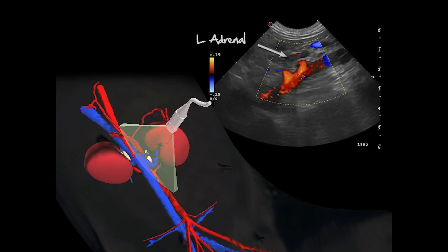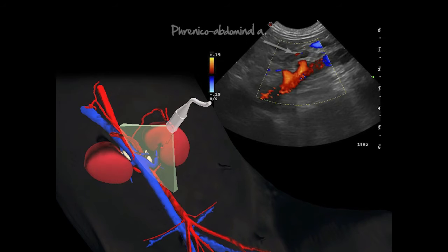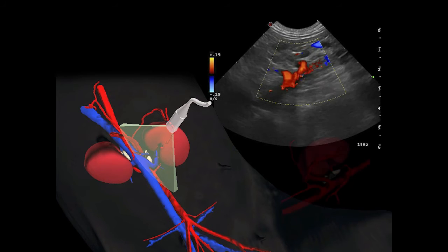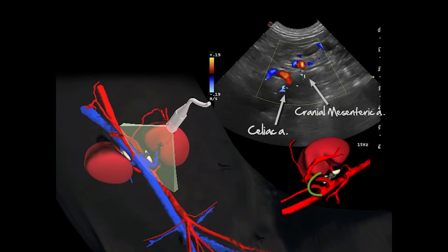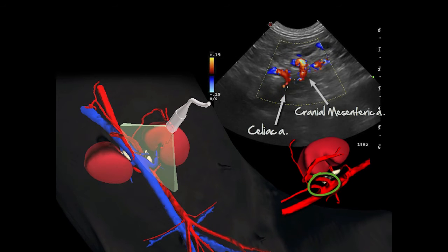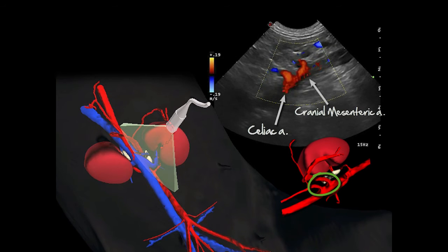The cranial lobe may also extend ventral to these arteries, as in this dog. Observe the small phrenicoabdominal vessel that runs along the ventral surface of the adrenal, as well as the celiac and cranial mesenteric arteries that branch off from the aorta close to where the adrenal is located.